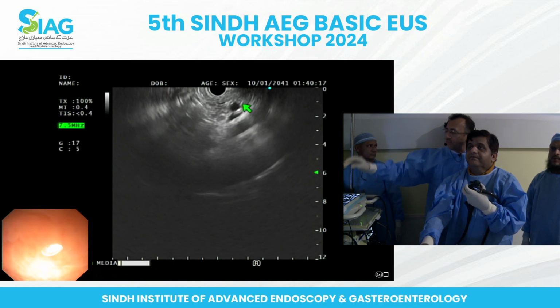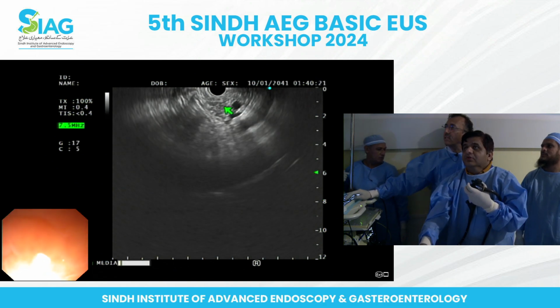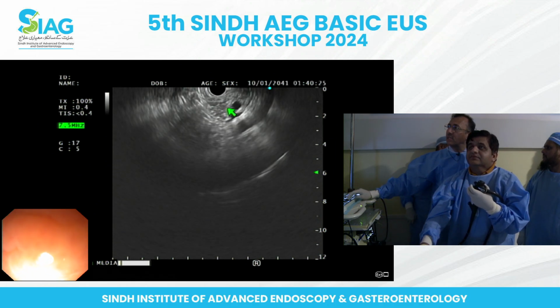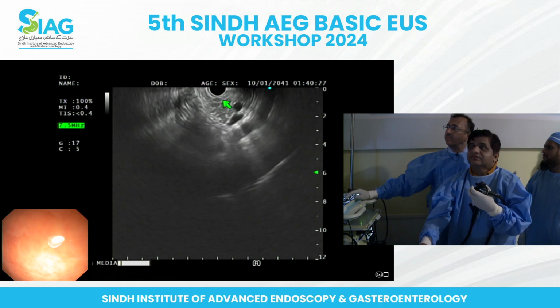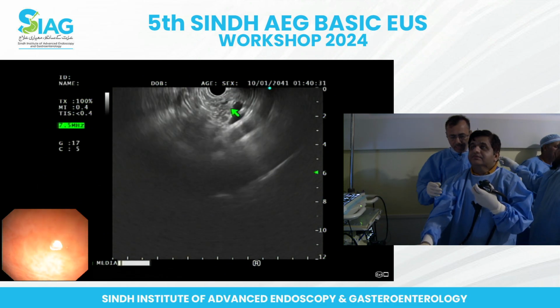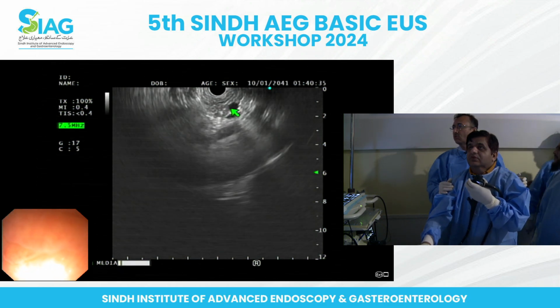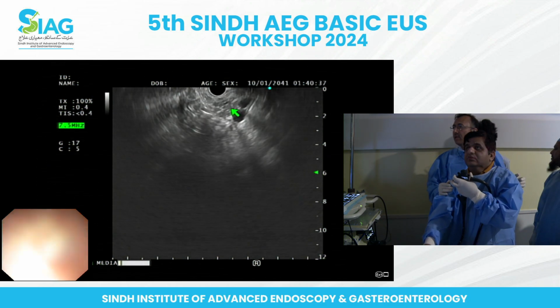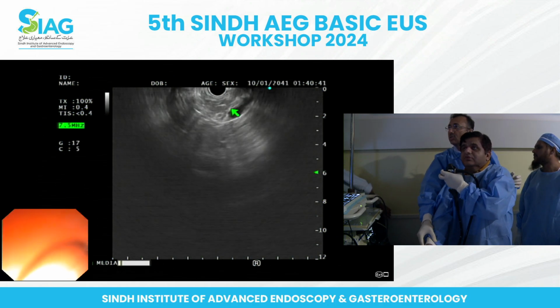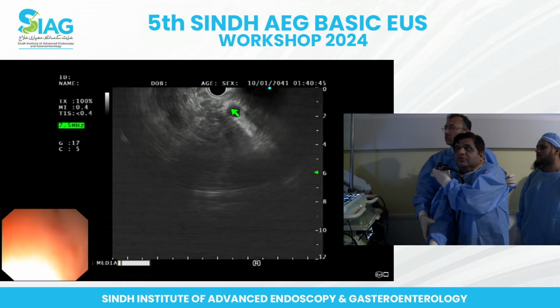Now, forget about this splenic artery, splenic vein. Your main focus is this pancreatic duct. Around the pancreatic duct, you have a nice parenchyma, a nice tissue of the pancreatic parenchyma. Now, once here, big wheel up and slight rotation to the right, to the clockwise. Big wheel up, and rotation to the right. And you're going towards the tail, and right there, slow.